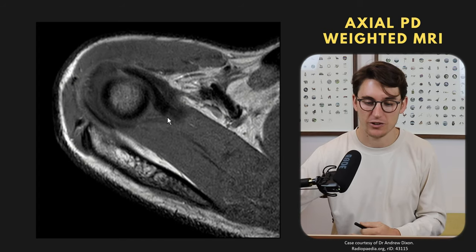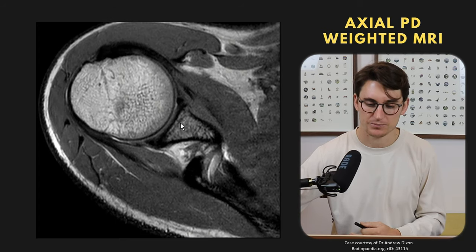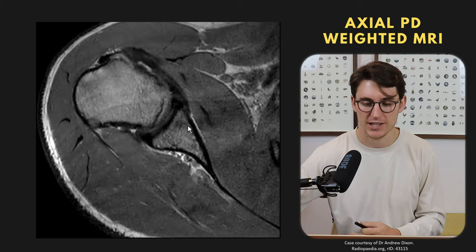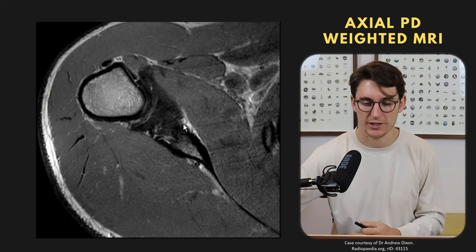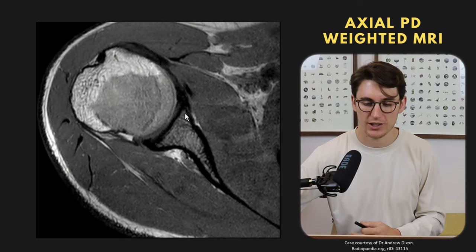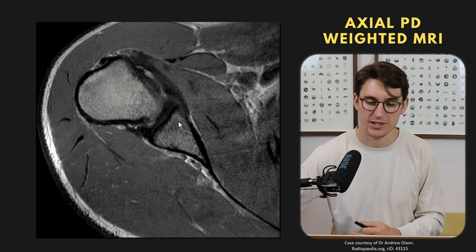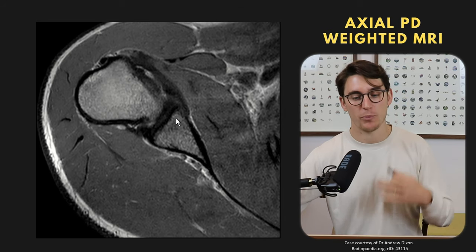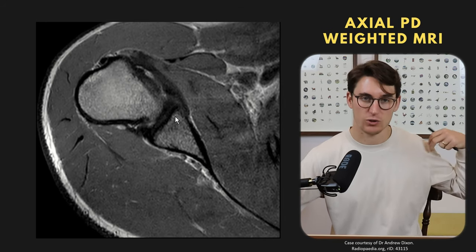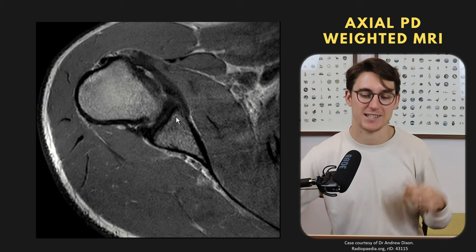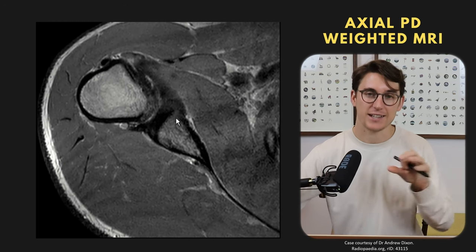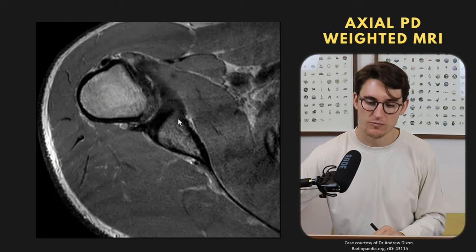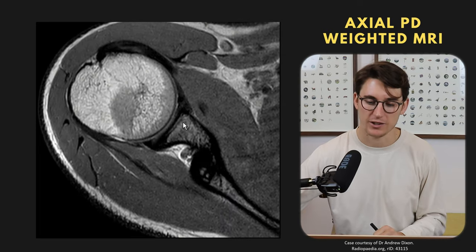Scrolling down inferiorly to the glenoid, it should have a good triangular shape. We look carefully at the anterior edge, especially the anterior inferior edge, for any bony Bankart lesions — that's when the shoulder dislocates anteriorly and causes this anterior inferior bit of bone to break off. In this case, we can see a normal glenoid.